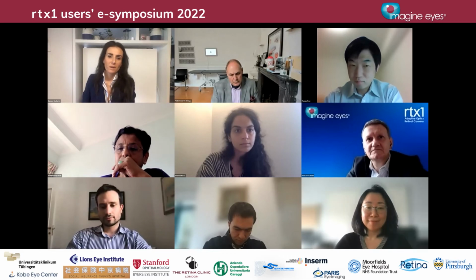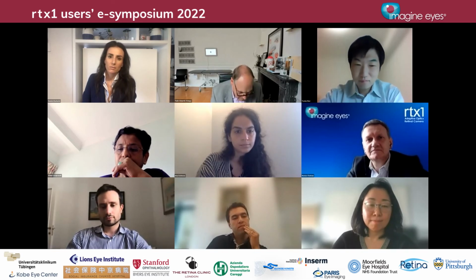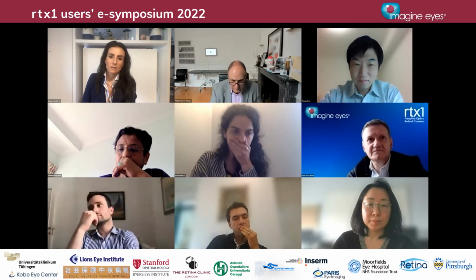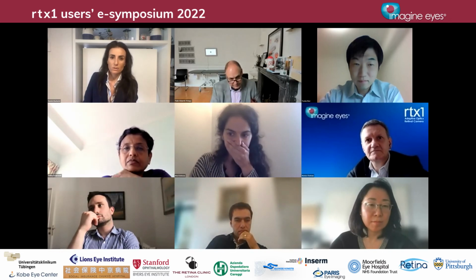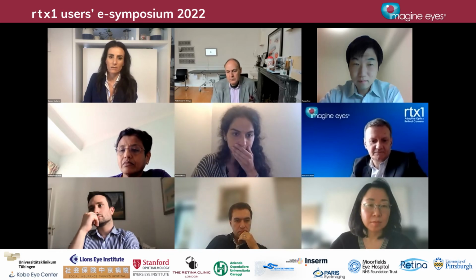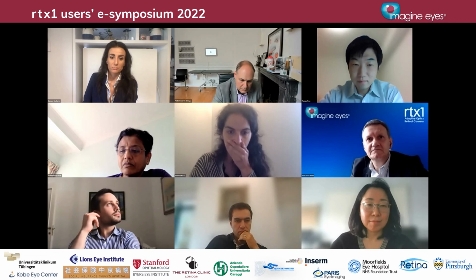Thank you. And I think that the high resolution of the endothelial wall is very important to detect, and there are no other techniques that can visualize in this way the deposits or other alterations that we can see in the endothelial walls of the retinal vessel. So I think that it could be a very useful tool also for some kinds of systemic pathologies.